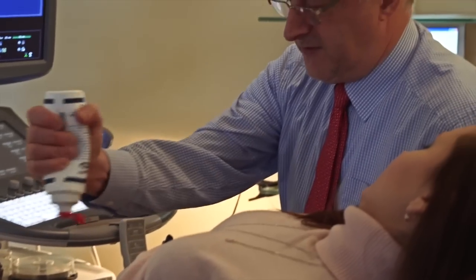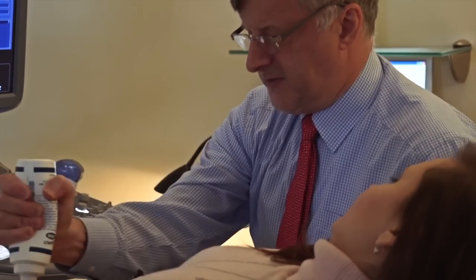The sexing scan is performed after 16 weeks of pregnancy. It can be performed at any stage after that, although interestingly it gets a little bit more difficult as the baby gets bigger and bigger. So between 16 and 26 weeks, but effectively any time after 16 weeks.